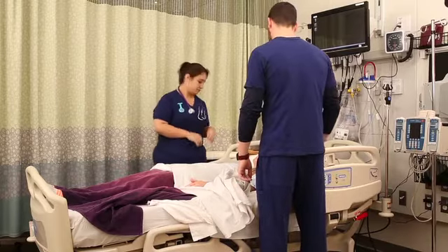In this video, we're going to look at a few highlights in patient mobility: moving a patient up in bed, getting a patient out of bed, and the use of assistive devices like a cane, walker, and crutches. So first, let's look at moving a patient up in bed.